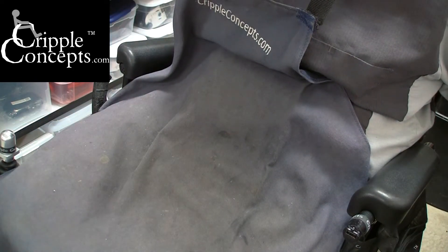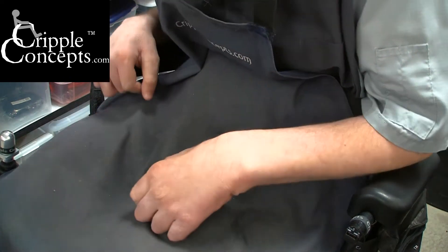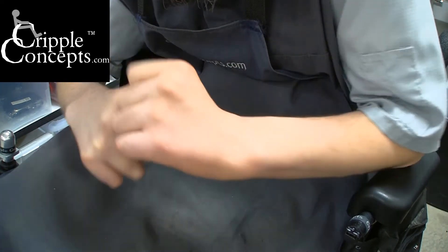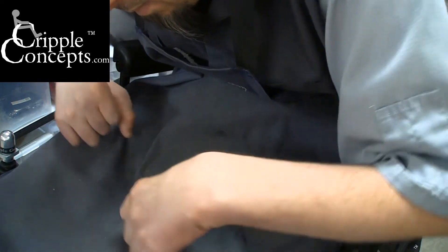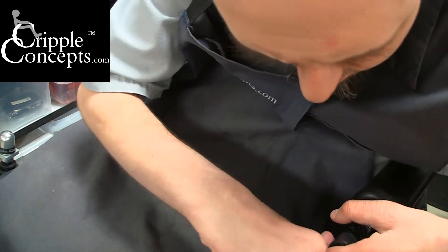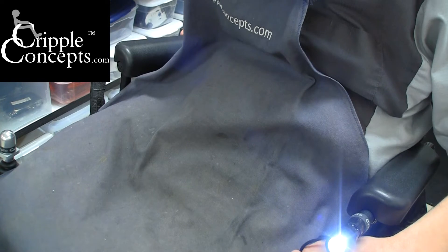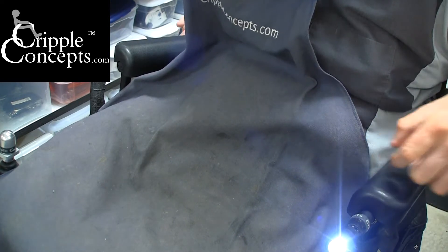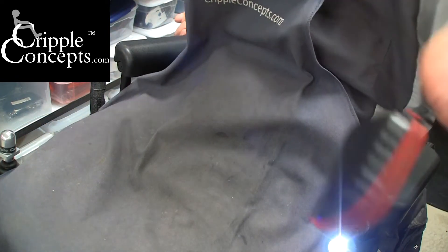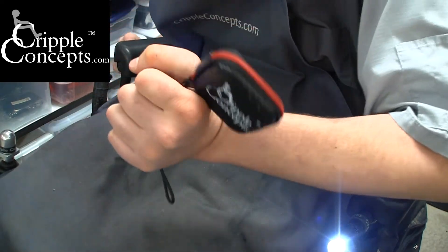They come as a standard charger or with a kit that includes a small light. It's not the brightest light in the world, but it will give you a little bit of light at night. The kit also comes with a zippered case — just a small zippered case also on a lanyard, with the Cripple Concepts logo on it.